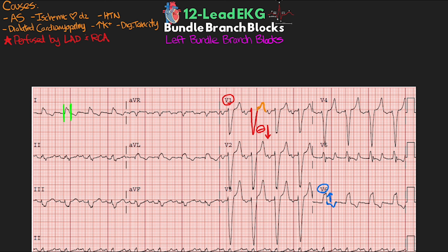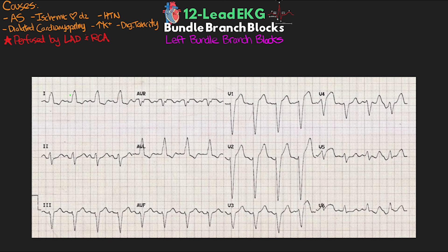In this second left bundle branch block example, the QRS is clearly greater than 0.12 seconds. Switching to V1, we see that deep wide negative terminal deflection — the turn signal method tells us we're turning left, thus left bundle branch block morphology. We again see positive J point shifting and positive T wave discordance, opposite of that terminal negative deflection. Looking at V6, it's not very clear, so we evaluate lateral leads 1 and AVL — things are a little clearer, particularly with AVL, showing a positive terminal wave opposite of V1 with negatively shifted J point and negative T wave discordance.